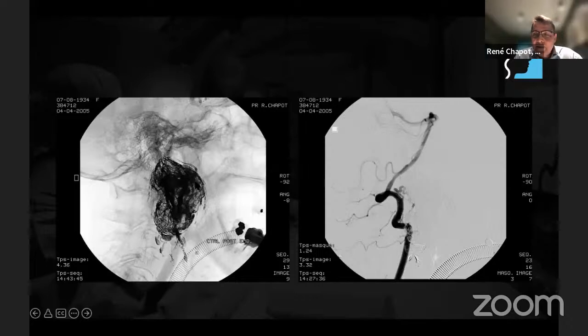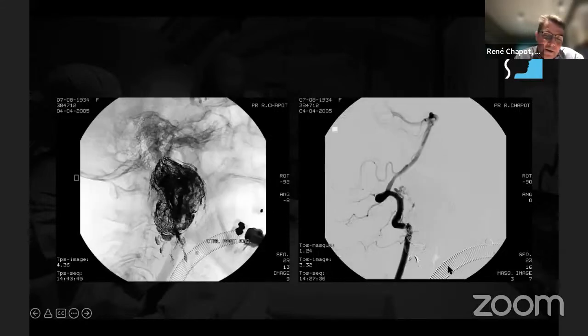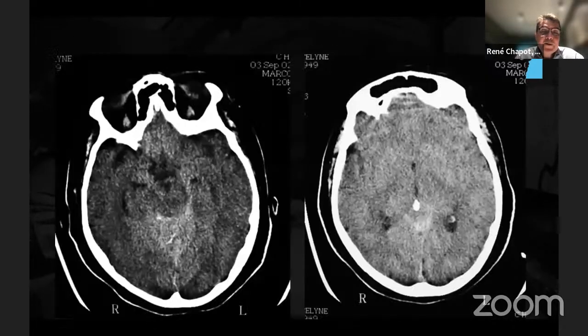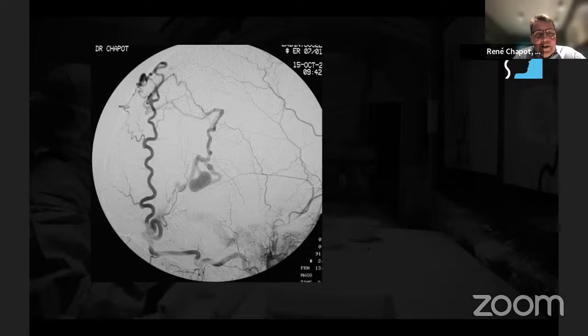This procedure becomes, because of this, very rapid. It just takes 30 minutes, and we occlude arteries and veins, which makes it become avascular. And you see here that those non-accessible feeders from the posterior circulation are done. So definitely direct puncture is a very nice way to proceed, but not only for tumors. Here is a patient that's, I think, 20 years old. She had some SAH, and the dural fistula was located at the inferior edge of the falx, with no supply from the internal circulation. The only supply was this occipital artery, which was getting transcranially through the parietal foramina.